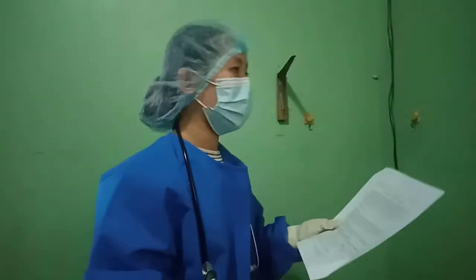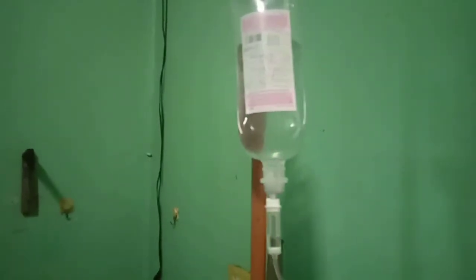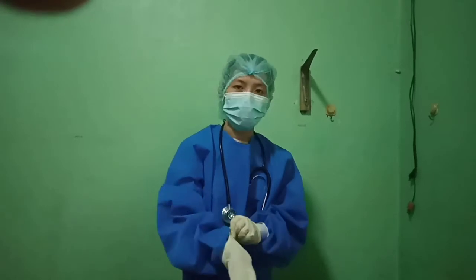This ensures the correct IV solution, the rate of infusion, and the medication will be administered. Promotes safe administration of IV fluids and medication. Hand hygiene and PPE prevent the spread of microorganisms. So identify the patient, ensuring the right patient receives the intervention, and help prevent errors.